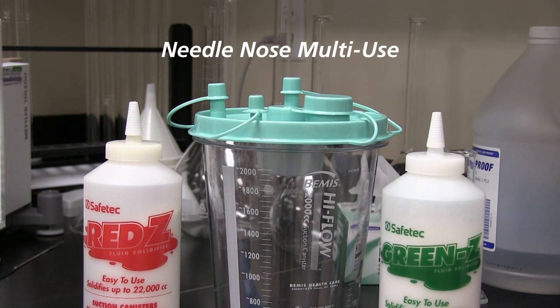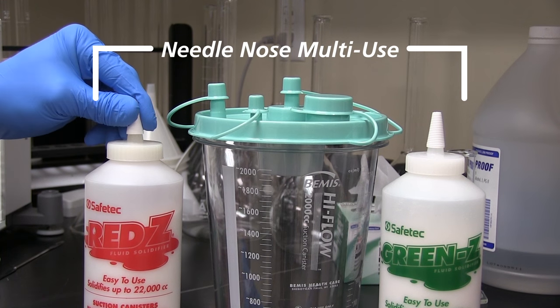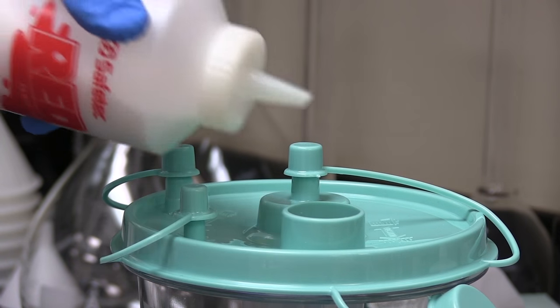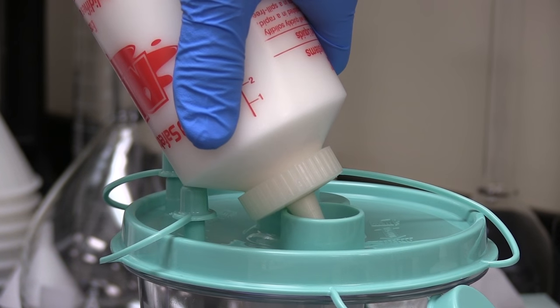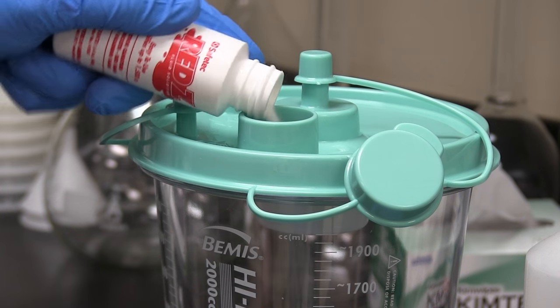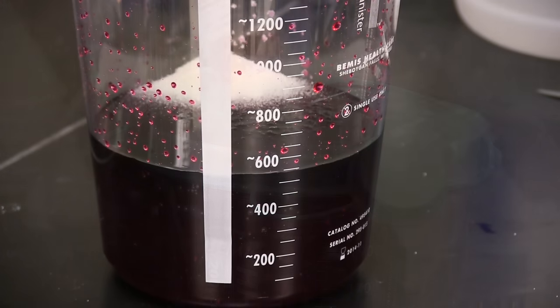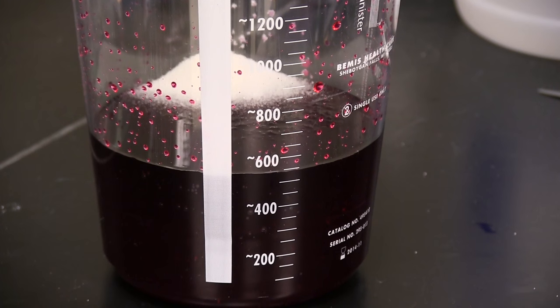When using the needle nose bottle, remove the cap, cut the tip, and simply pour the needed amount of solidifier into the porthole of the canister. Solidification times will vary based on canister content. Once you are done with the solidifier, replace the cap for future use.